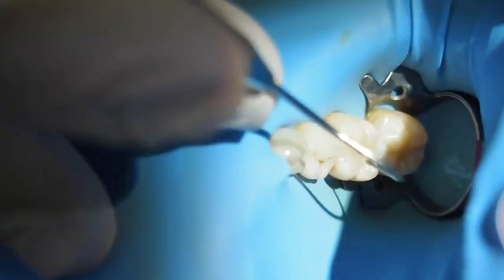The stain will stay in the deep part of the fissure for a while. Some glycerin lubricant to allow us to keep a layer of the composite.